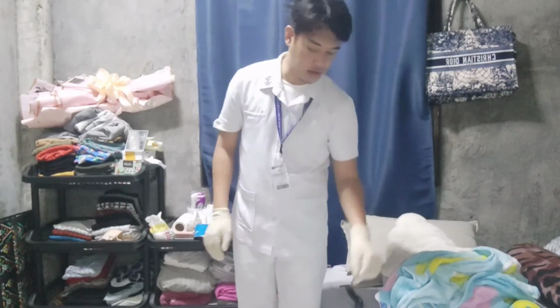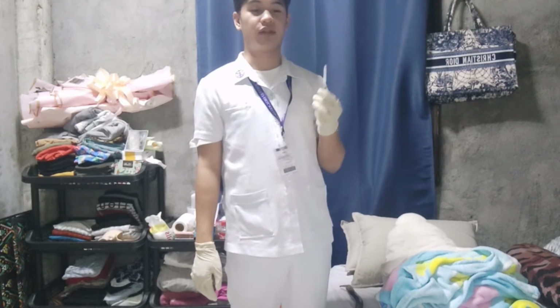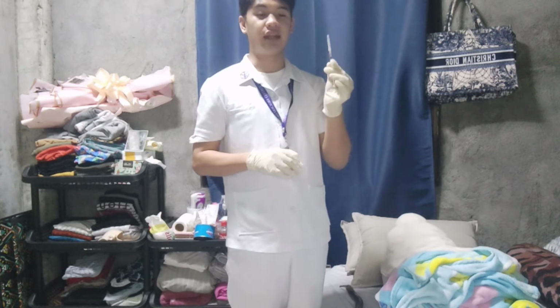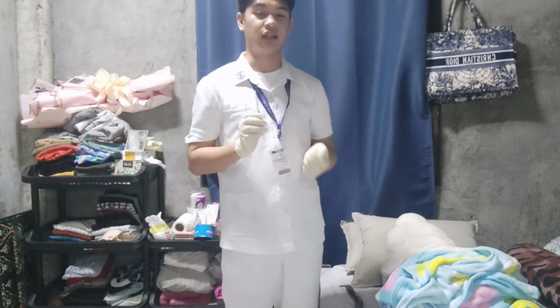Next, prepare the syringe for injection. We need to remove the needle cap while waiting for the antiseptic to dry. Expel the air bubbles from the syringe; small bubbles that adhere to the plunger are of no consequence. Grasp the syringe with your dominant hand close to the hub, holding it between the thumb and the forefinger. Hold the needle almost parallel to the skin surface with the bevel of the needle up.